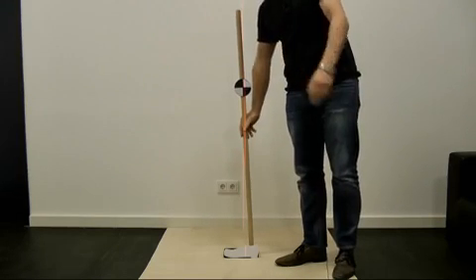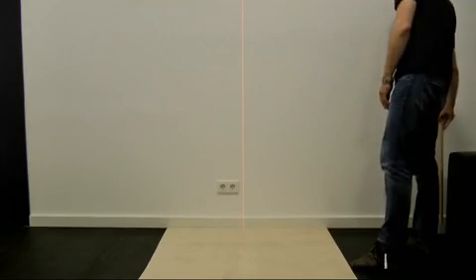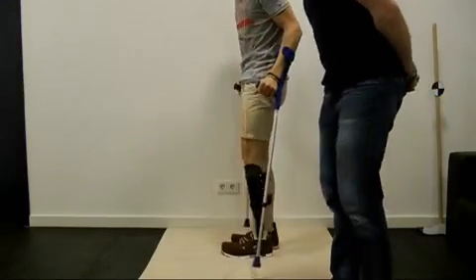In the meantime, Henrik has already put his orthosis on. So now we can check what was just discussed directly on the patient. That is, the difference between being able to stand and not being able to stand steadily.